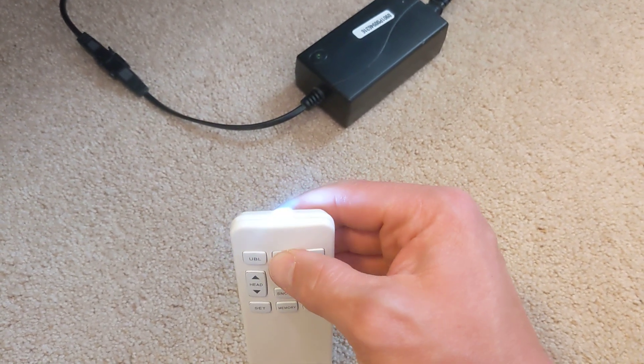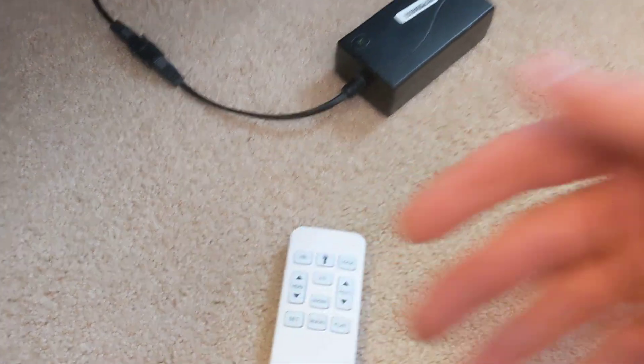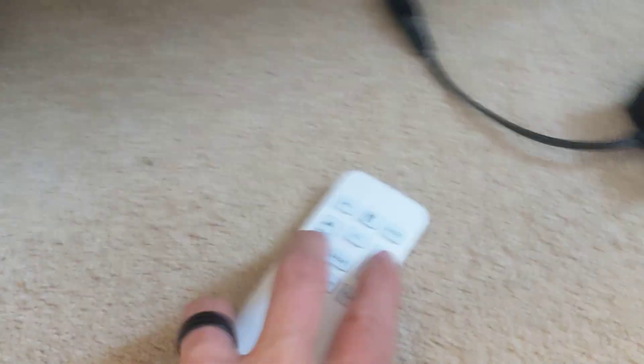So you gotta hold that button down. Make sure that light is turning on. When that light is turning on, you're gonna press the following — you're gonna press head down.